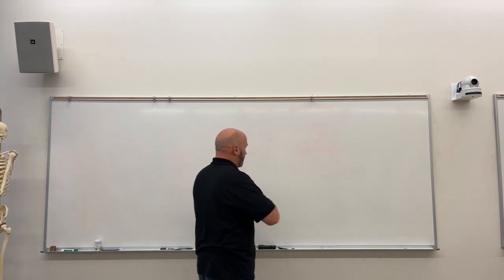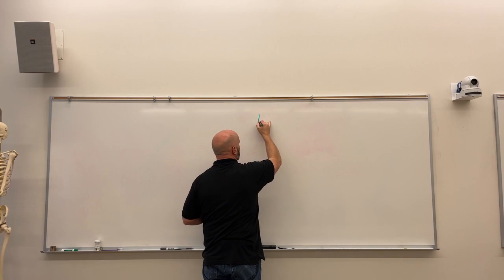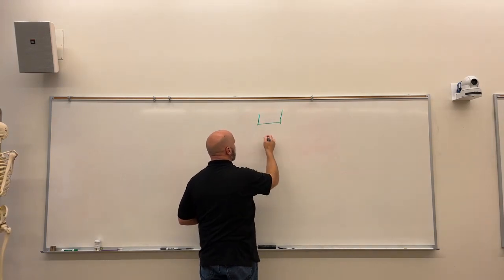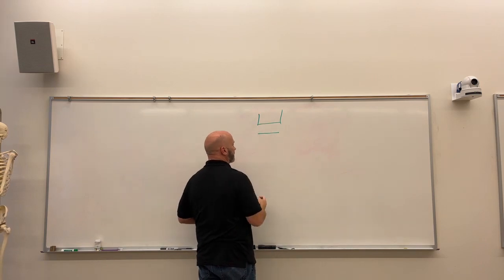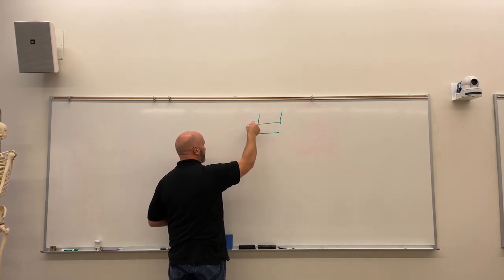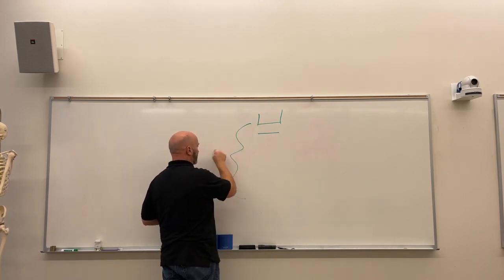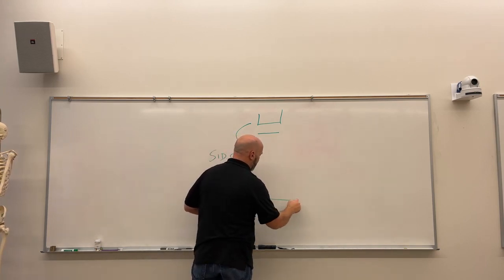So what you're going to have are questions that say something to the effect that you've got your X-ray tube, that's your tube housing, and then you've got a diaphragm, and it's at some distance from the focus or from the tube housing. And then you've got a specific SID. So you've got an SID here, and you've got a projected field size, right?